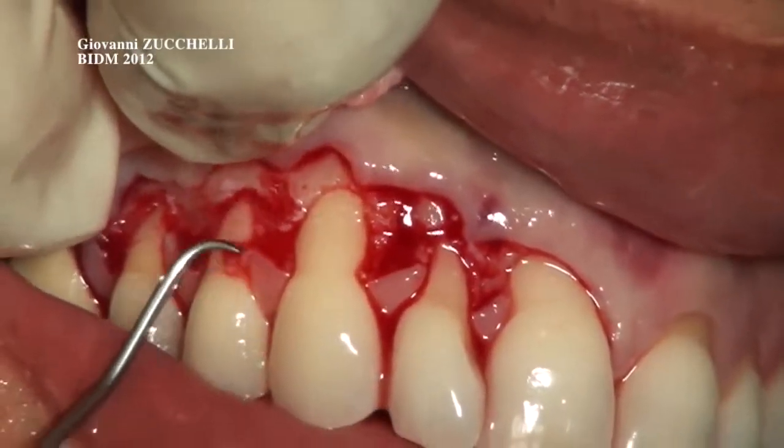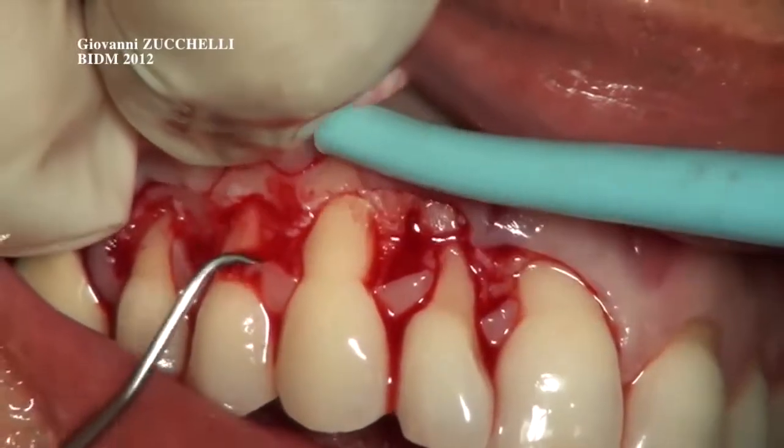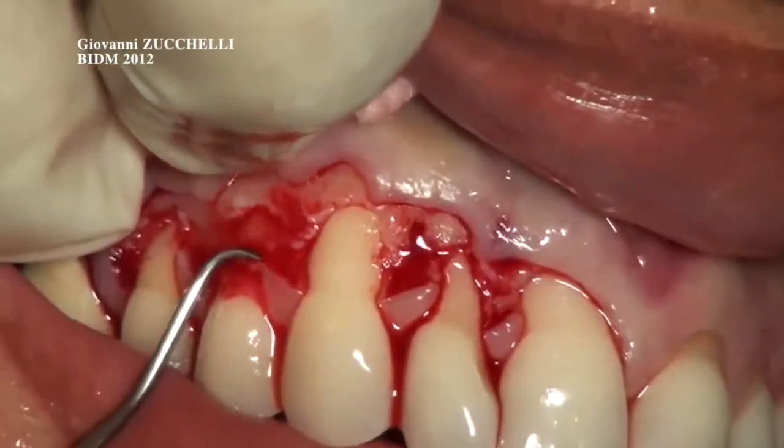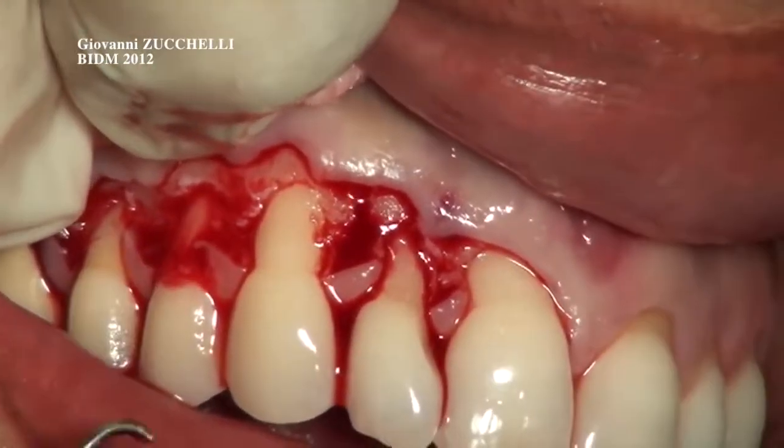Root planing is a critical aspect of the mucogingival procedure since you are preparing the root for the attachment of the soft tissue.